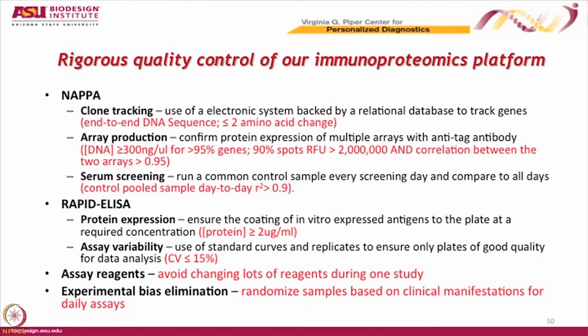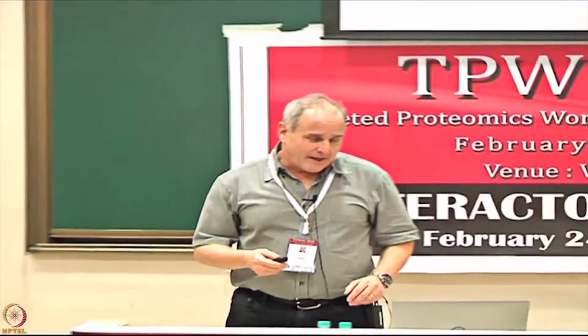You'll think you found something really good, and then you'll discover a year later, after investing all of your time in it, that it was an error because you just didn't load them in the right order. So don't miss that. I had a postdoc who chased his tail for 4 months, thinking that he had found something really cool. And when we got down to it, it was because he ran the case plate first and then he ran the control plate second. And the control plate sat for 10 minutes while the case plate was getting read. And that was the difference. So you can't do that.